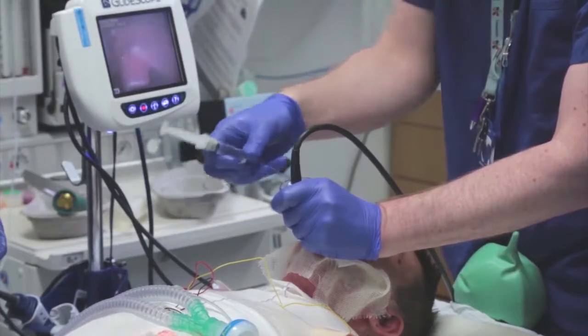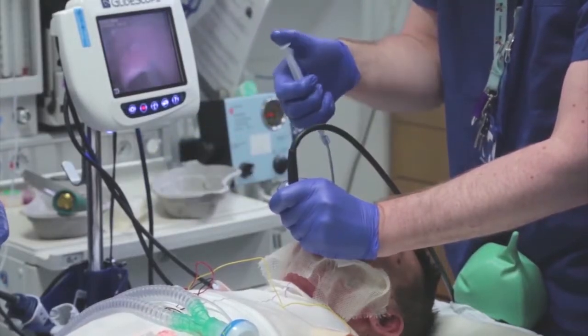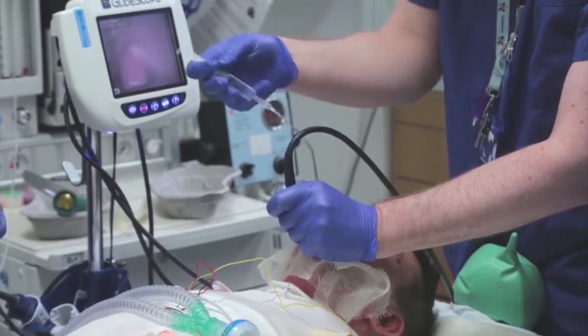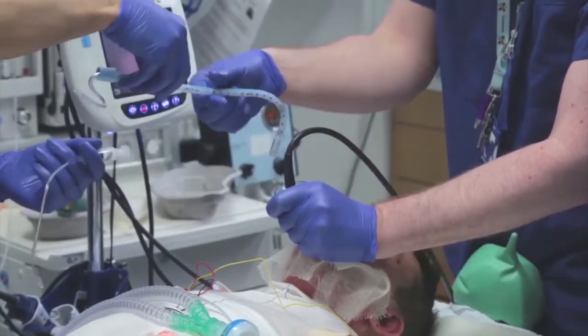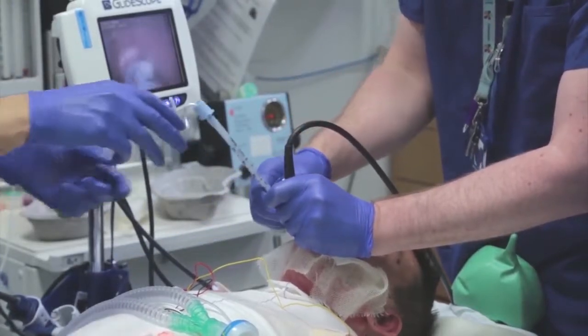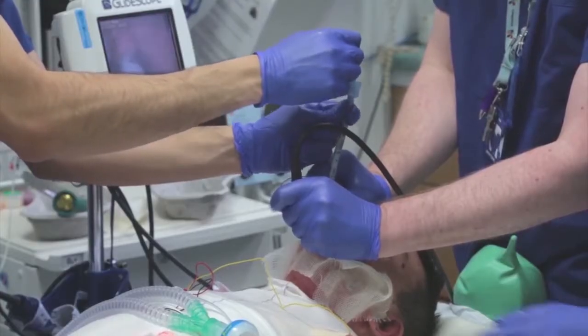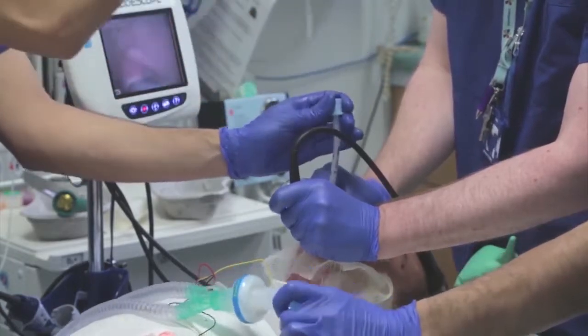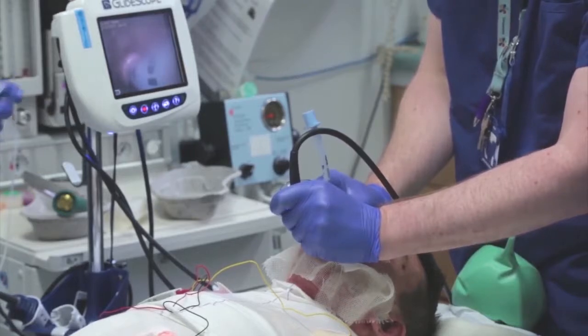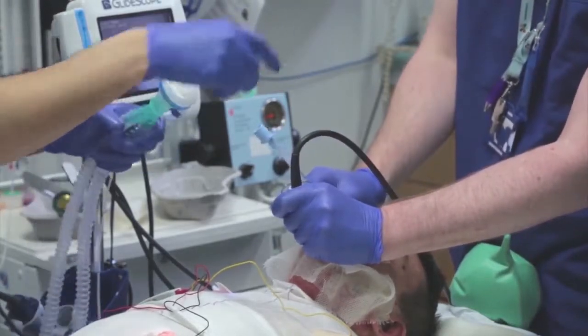Visualization of the vocal cords is achieved with the video laryngoscope, and the cords are sprayed with lidocaine. The endotracheal tube is carefully placed into position and the supporting stylet removed. In this case, the endotracheal tube size that is selected is a little small.